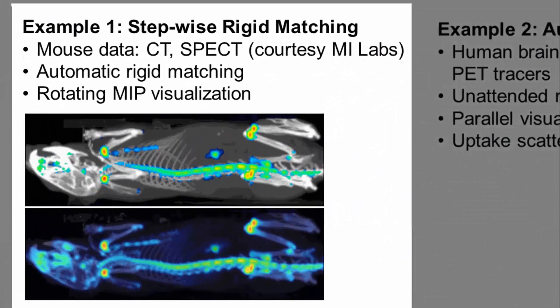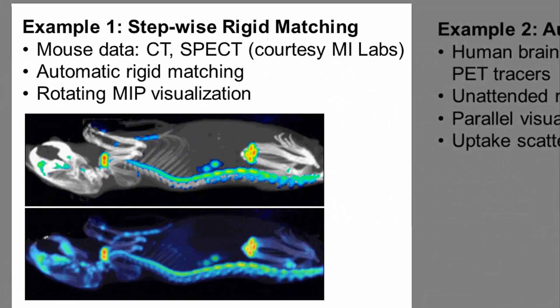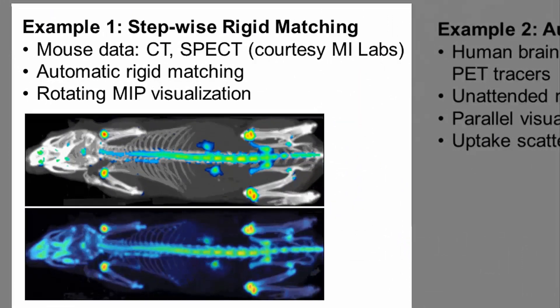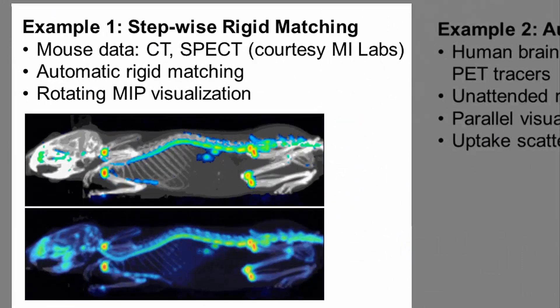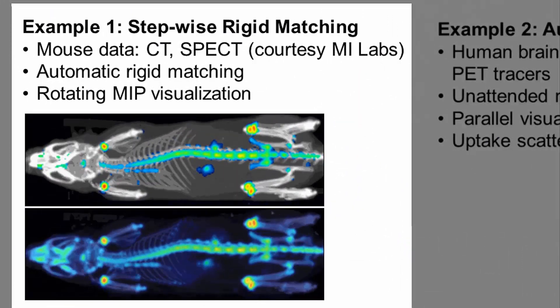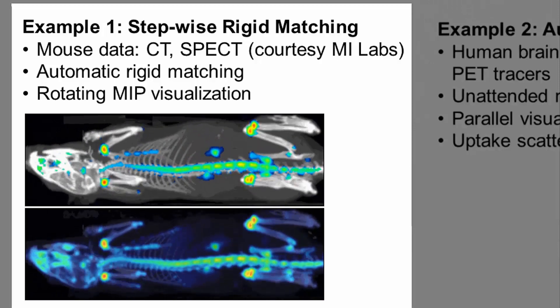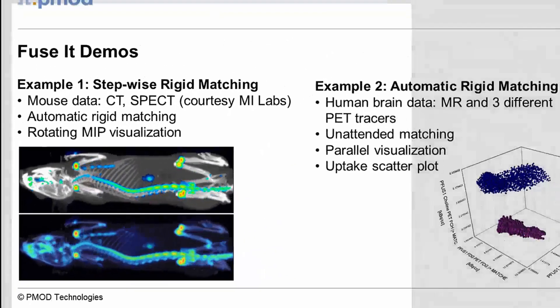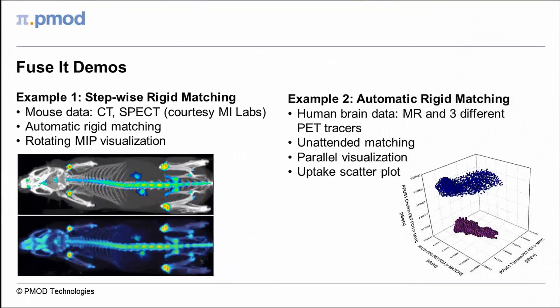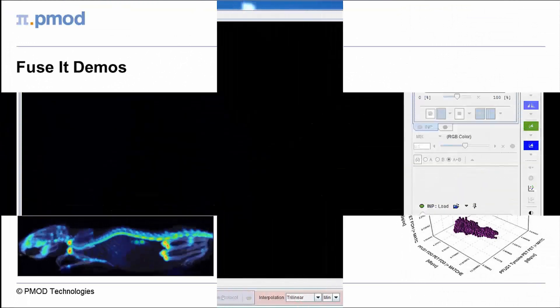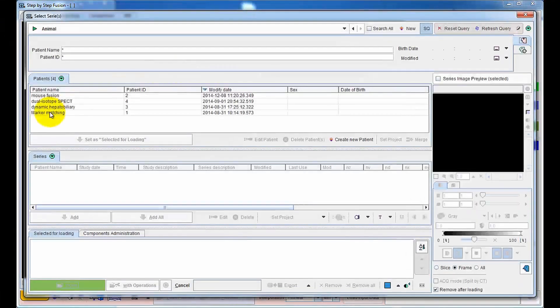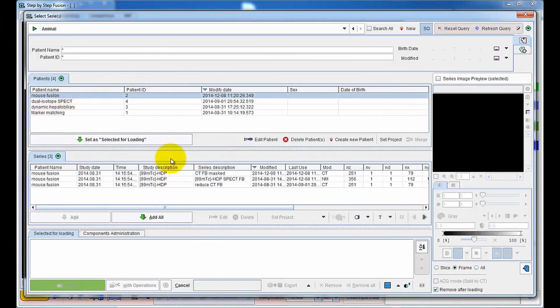The first example illustrates the stepwise registration approach. It uses mouse data sequentially acquired in a combined SPECT CT scanner, so that rigid matching can be applied. Stepwise processing starts with loading the SPECT data.